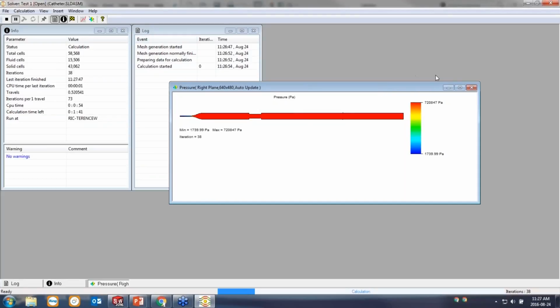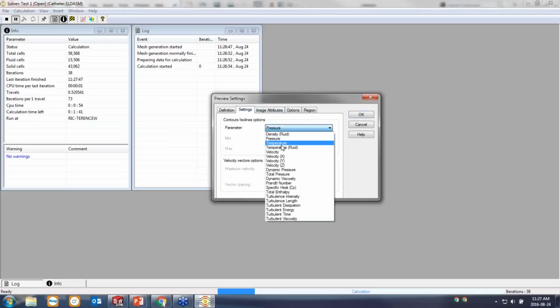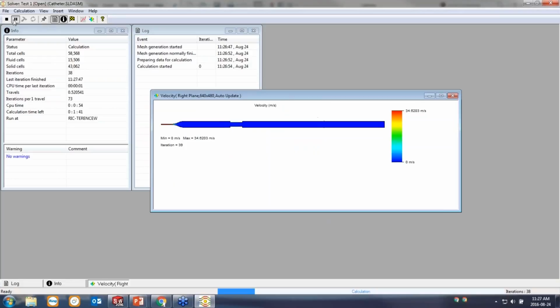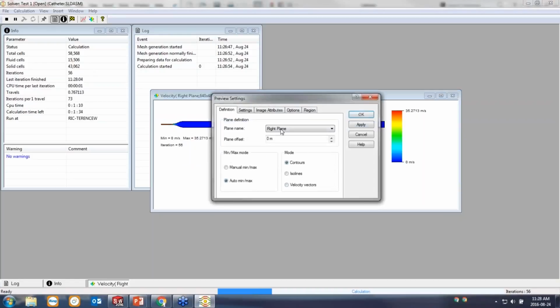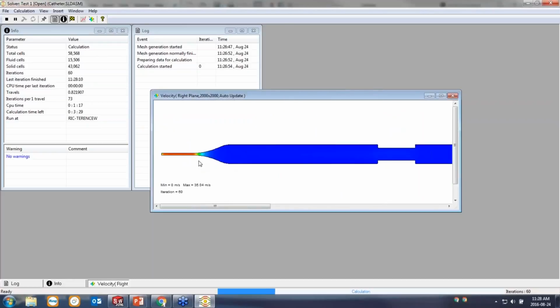If I pause this again, go back, and let's take a look at this plot, but let's switch it to take a look at something like the velocity this time. All right, and so I can see these values as well. On this particular model, the area of interest is pretty small, so might want to go ahead and crank up the size, and we can see that updating.